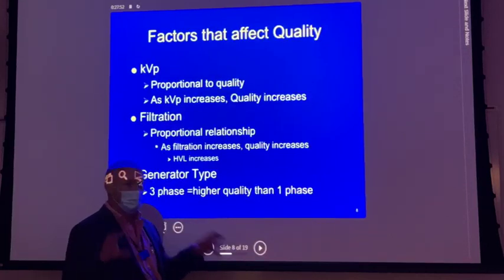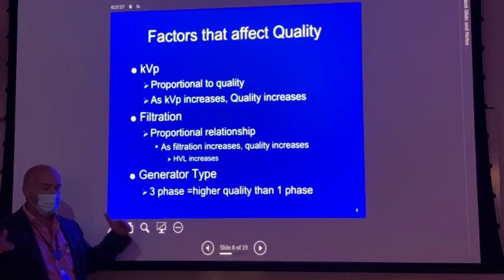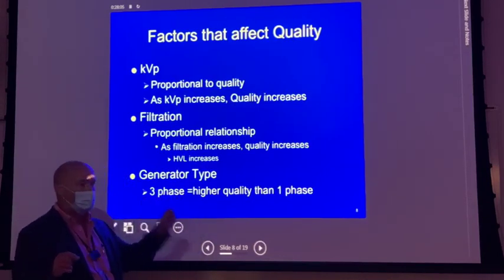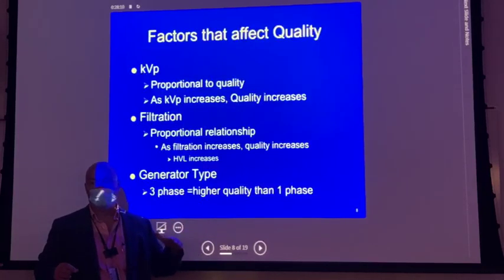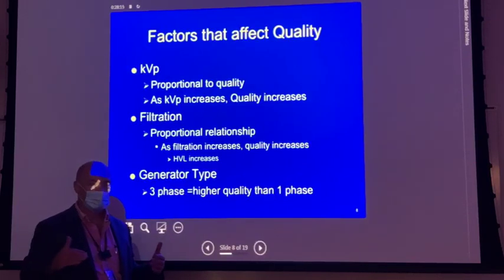So it looks like you've got exactly the same exposure in the two, but if you put a single layer of aluminum into both, 1 millimeter of aluminum into both x-ray beams, and you've got one that cuts it down from 100R to 50R, that's its half value layer, right? 1 millimeter of aluminum cut its intensity in half.